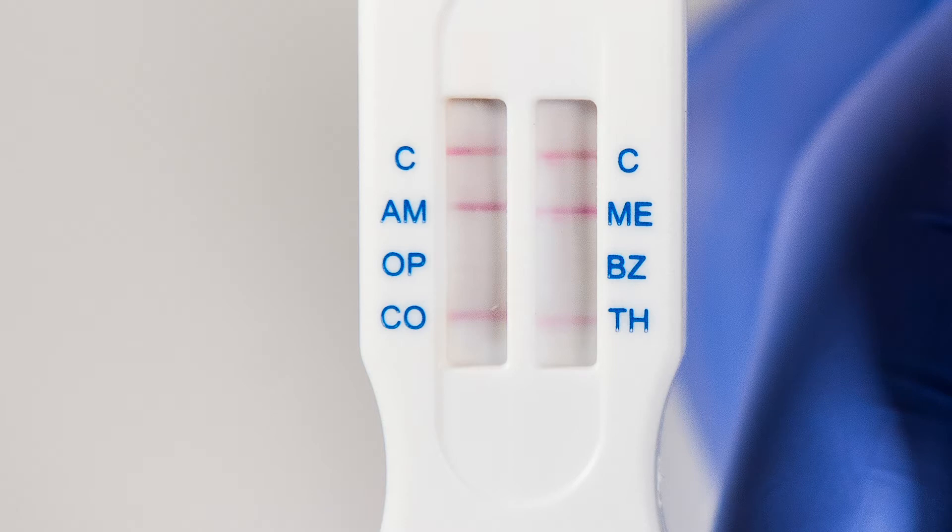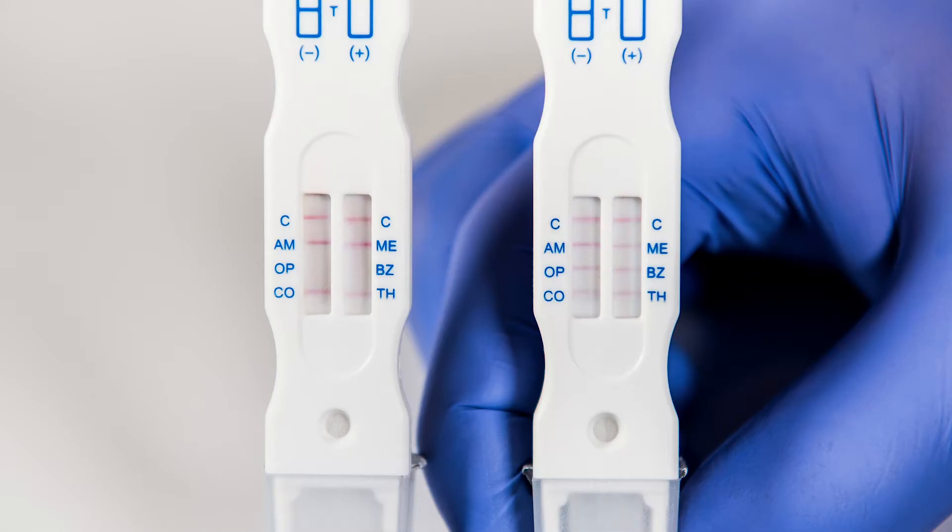In this example, we can see the subject tested positive for opiates and benzodiazepines. Remember, the presence of a line indicates negative results, and only the complete absence of a line indicates the presence of drugs in the saliva sample.